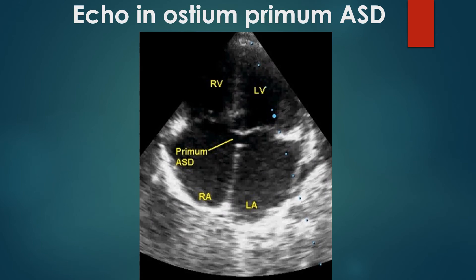Echocardiogram in apical 4-chamber view demonstrating a primum atrial septal defect. Primum ASD is part of the AV canal defect and is sometimes called a partial AV canal defect. In AV canal defects, the AV septum is absent and both AV valves are at the same level. Primum ASD is usually associated with a cleft of the anterior mitral leaflet, which produces significant mitral regurgitation.